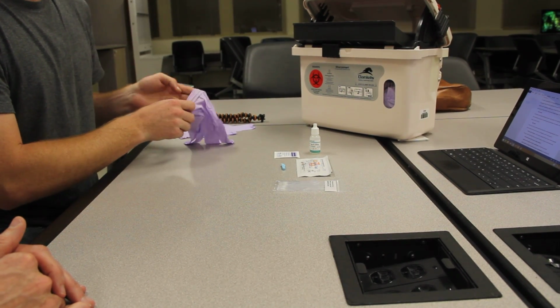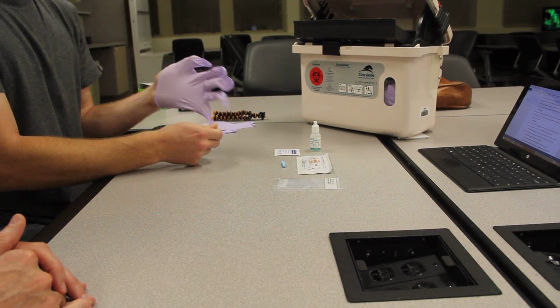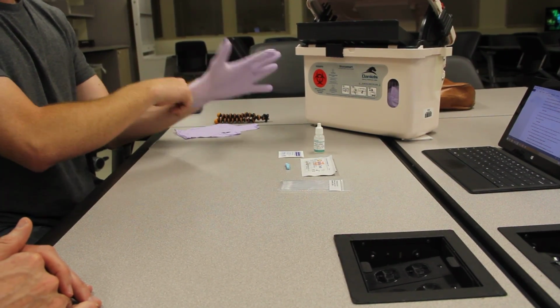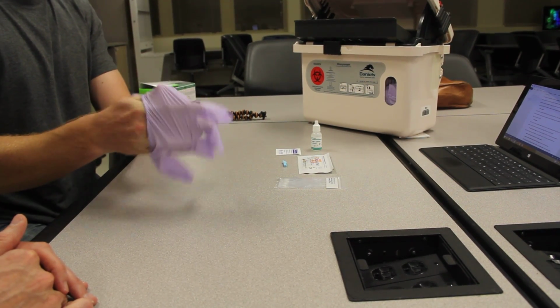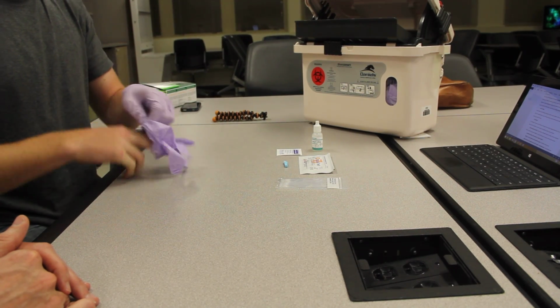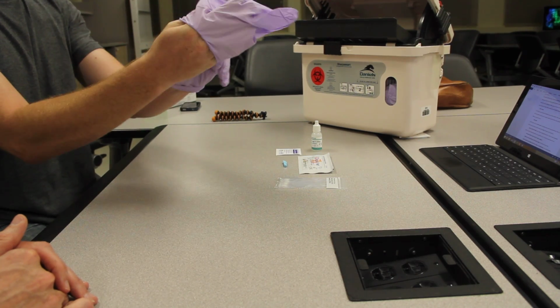The first step in any test that uses blood is to put on a pair of gloves. This is important for safety, both that of the patient and your own. You want to make sure that neither of you catches a blood-borne infection as a result of the test. So I'm just going to struggle with these latex gloves here.